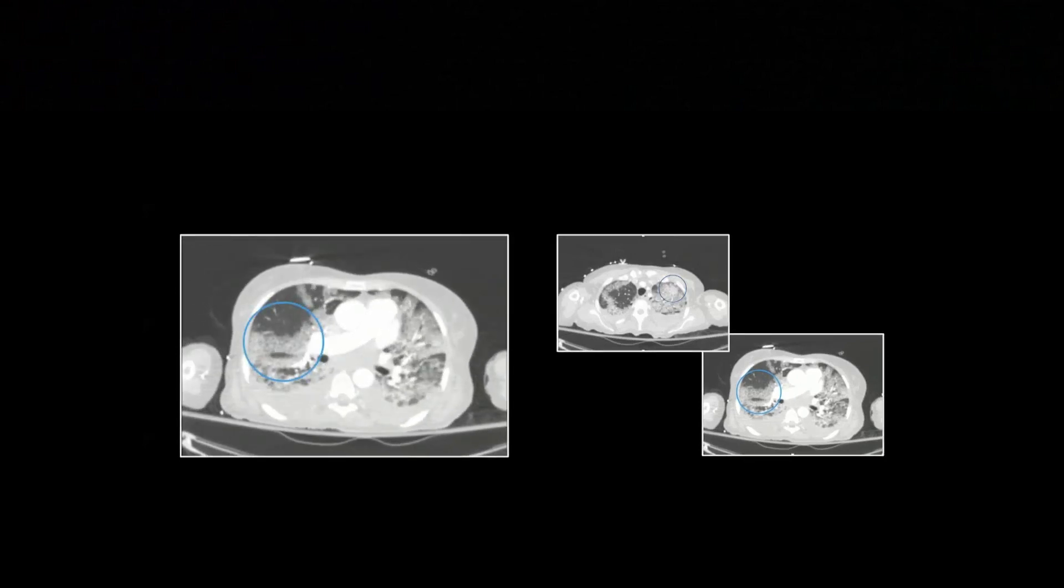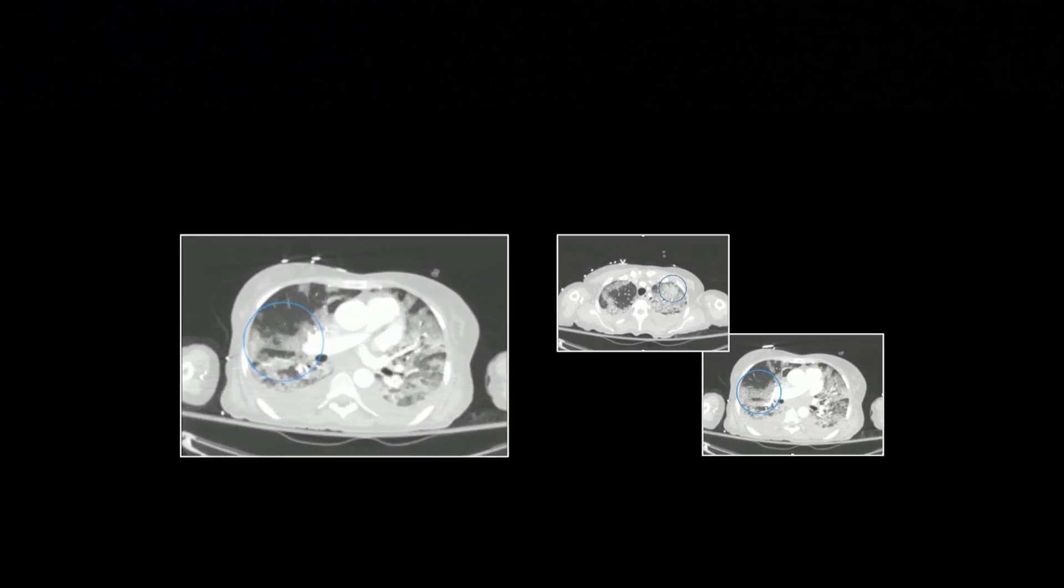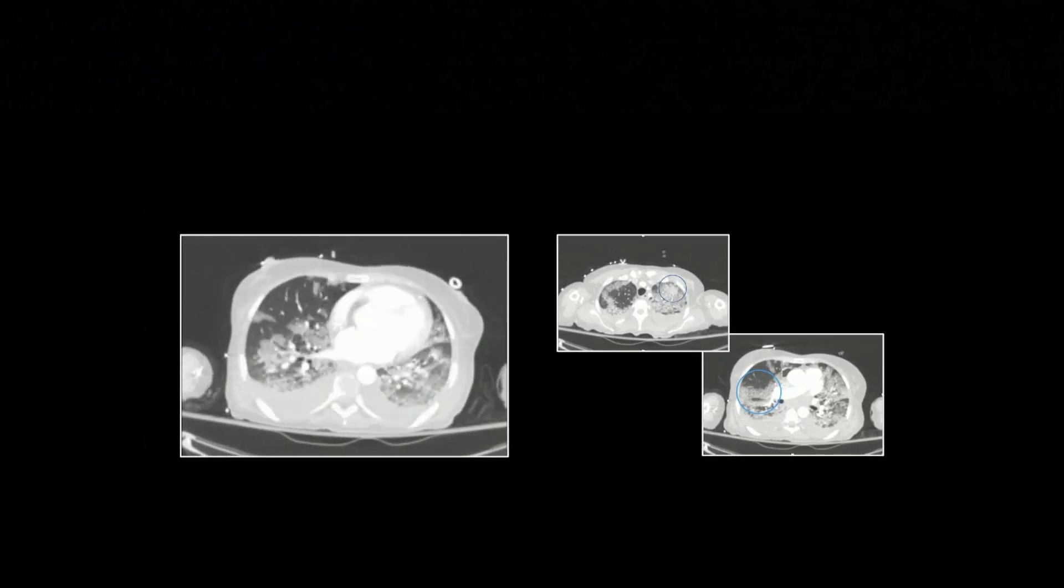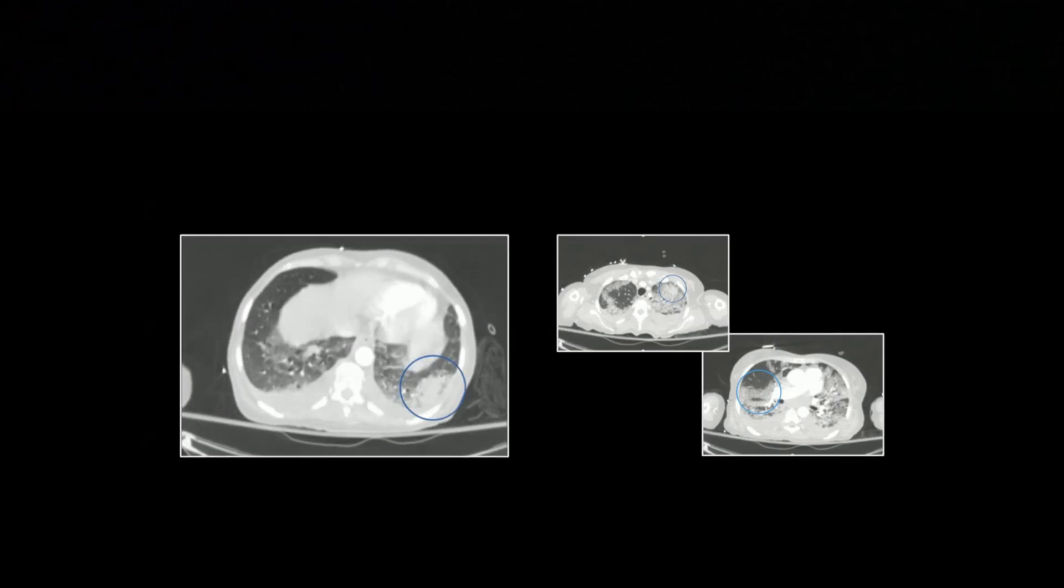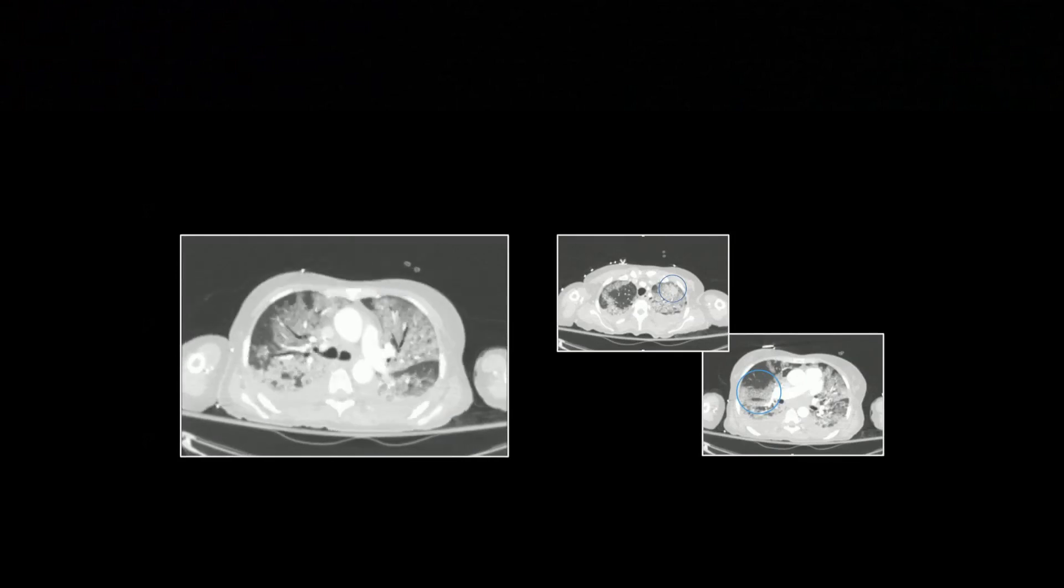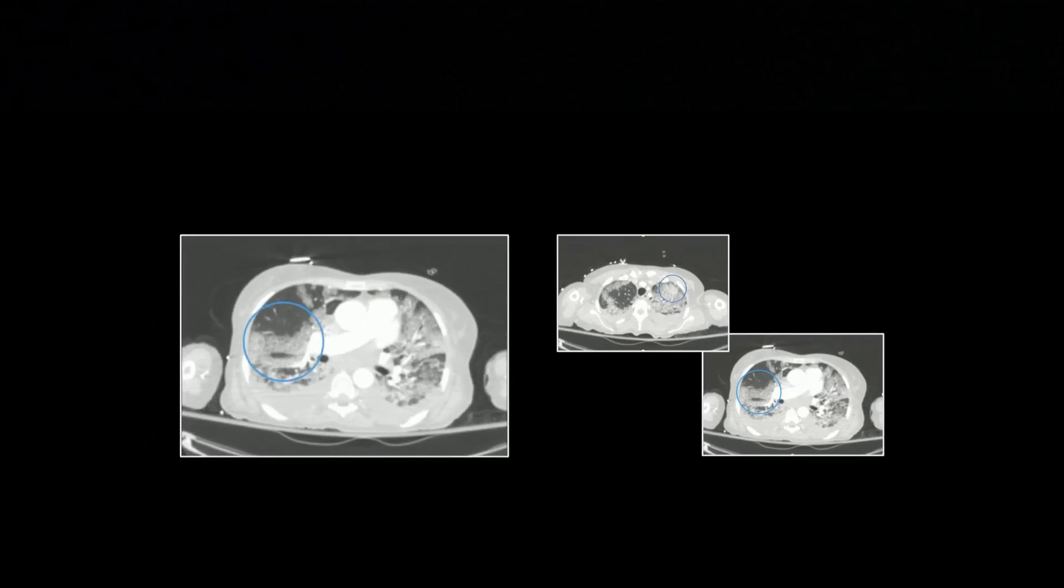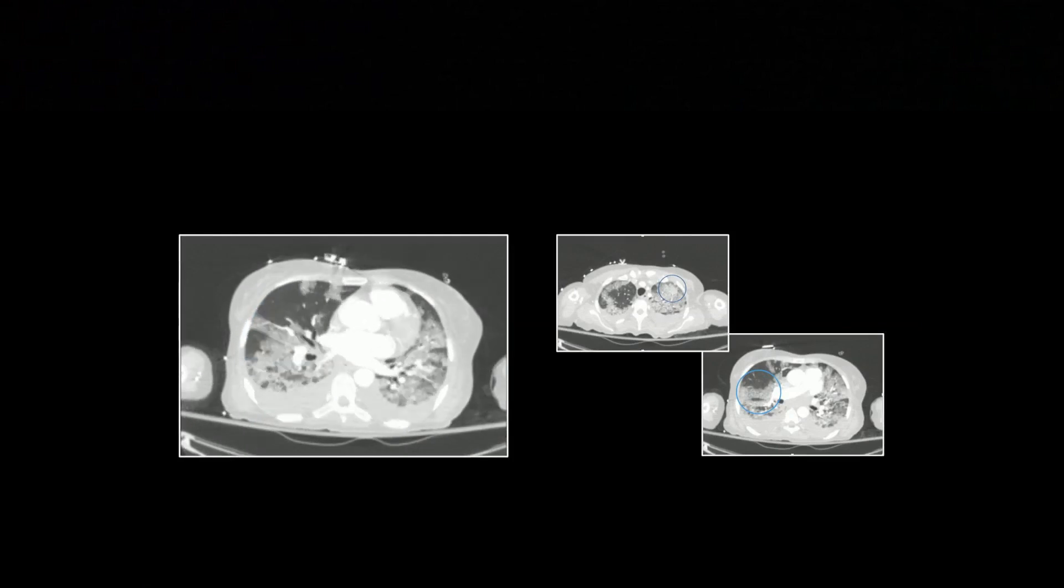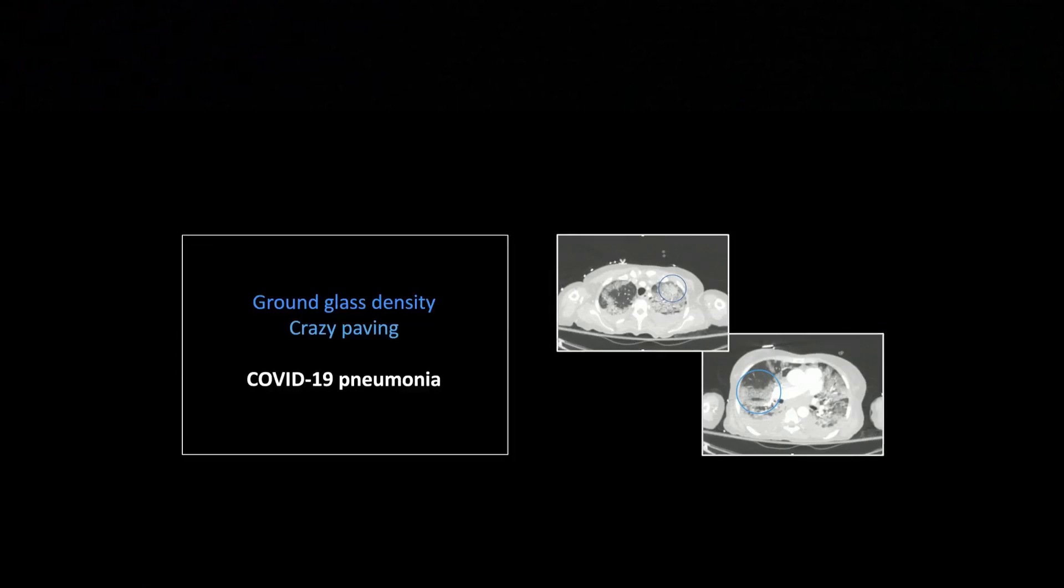Right in there is that frank consolidation within an area of ground glass. One of my old attendings used to say ground glass was like looking at someone in the shower through that frosted glass. You can tell there's someone in there, but you can't see the detail. That's kind of what it's like. You can see the vessels and other structures running through, but it's a little fuzzy because of the parenchymal density. That's another case of COVID-19.